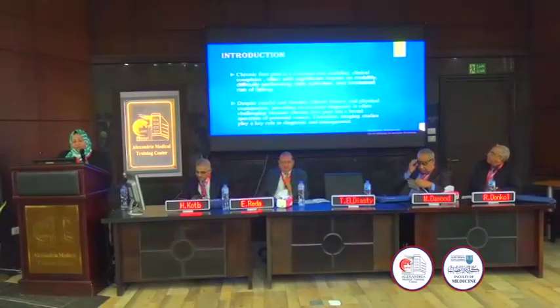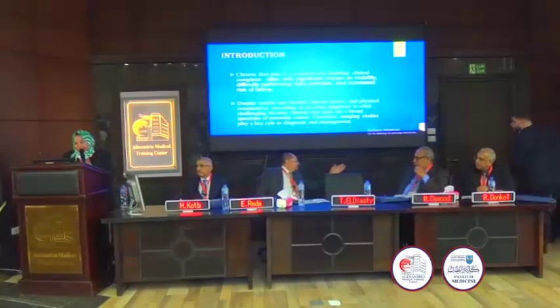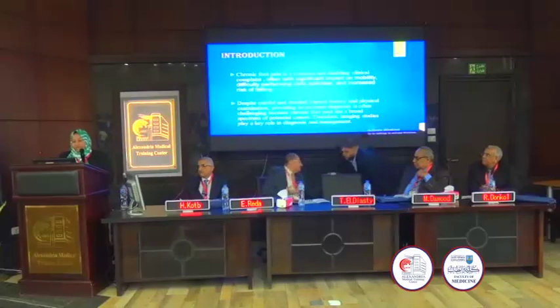I will start rapidly by saying that chronic foot pain is a common clinical complaint, often with significant impact on patient mobility, difficulty performing daily activities, and increased risk of falling. And despite careful clinical history and physical examination, providing an accurate diagnosis is often challenging because it has a broad spectrum of potential causes. Therefore, imaging plays a key role in the diagnosis and management.